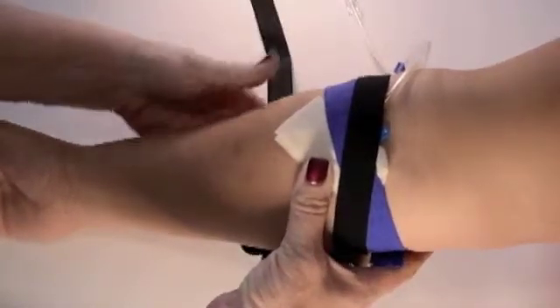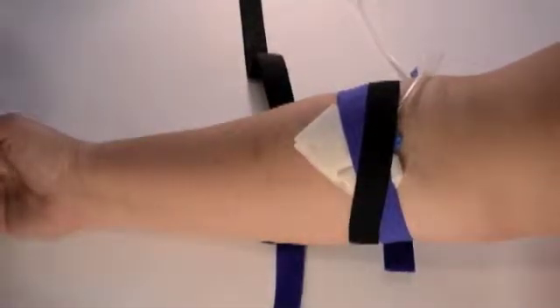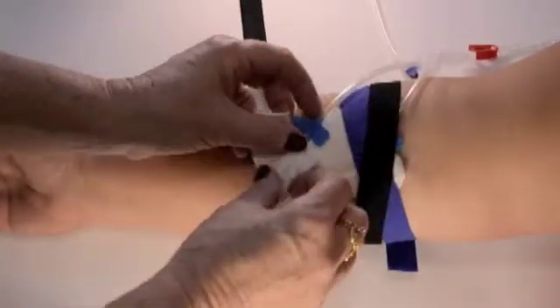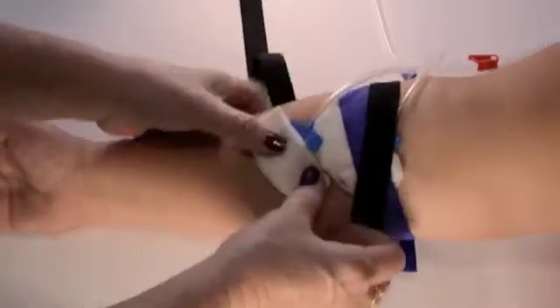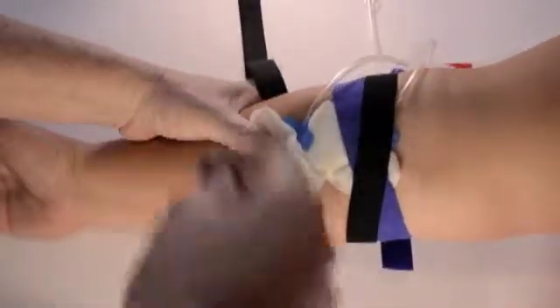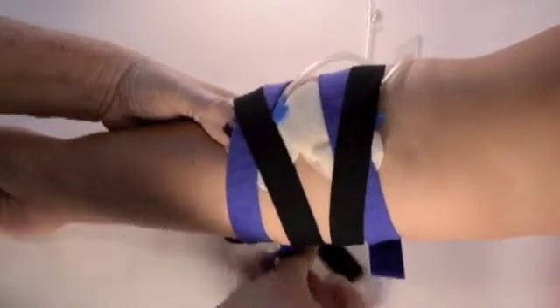Repeat steps for the second needle. Verify with the patient that the needles and the straps are comfortable, and adjust the strap tension as necessary.